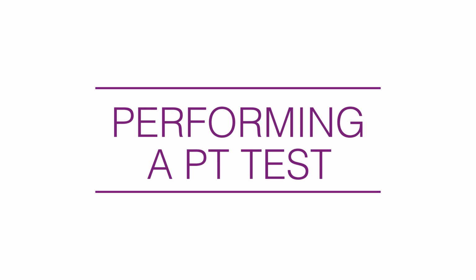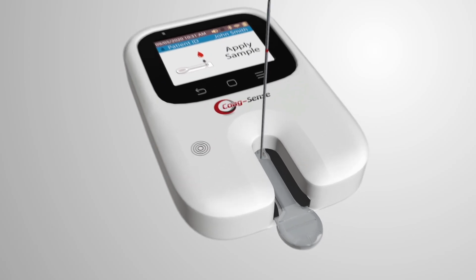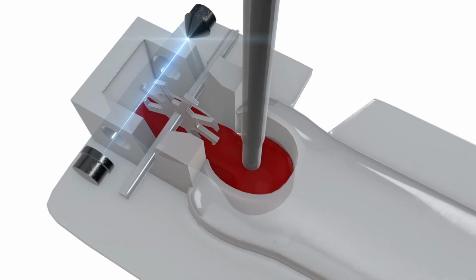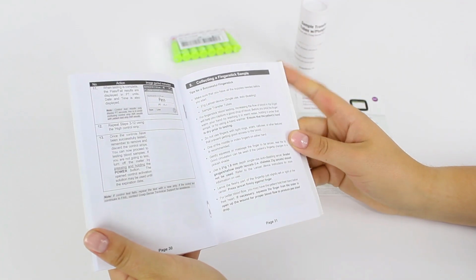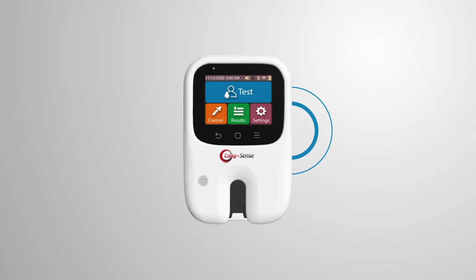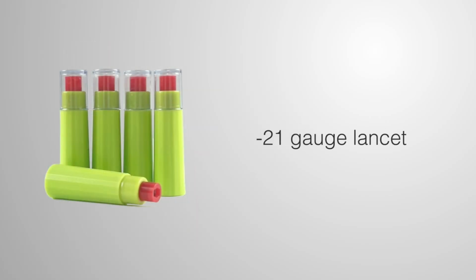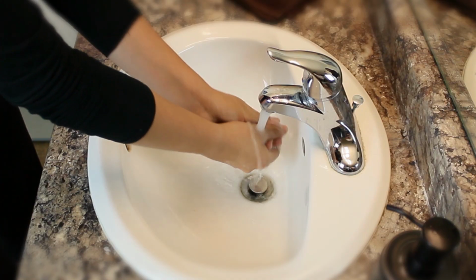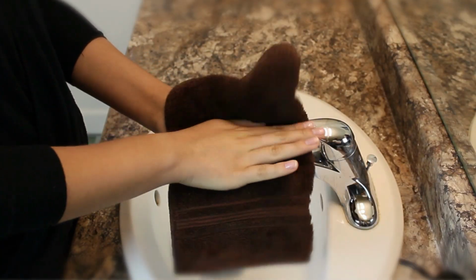Performing a PT test. This video provides a brief overview of how to perform a PT INR self-test. Be sure to read your entire user's manual carefully before you use your system. Make sure that you have all the supplies needed before you start, including a test strip, 21-gauge lancet, and sample transfer tubes. Wash your hands with soap and warm water and dry them thoroughly before testing.